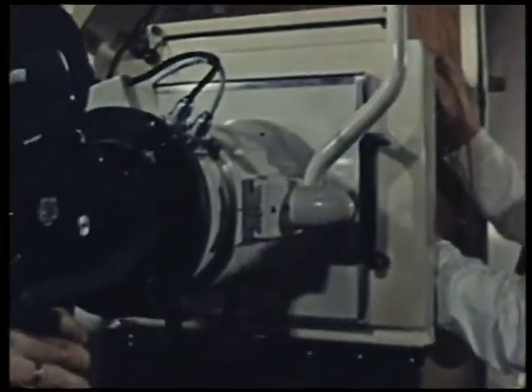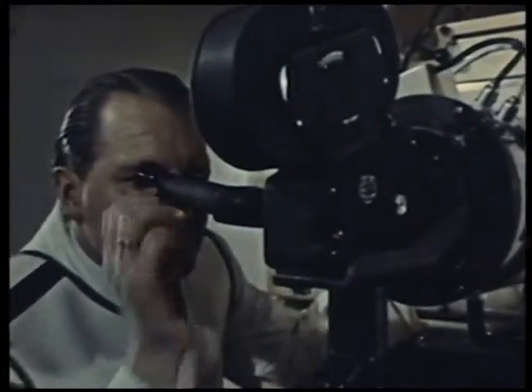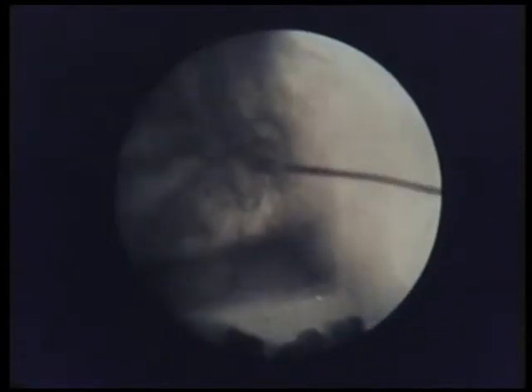Then, by means of cineradiography, its further progress is observed. After it has passed through the posterior nasal aperture, it slides over the posterior nasopharyngeal wall into the laryngopharynx. It then passes behind the epiglottis and pauses just above the vocal cords. It passes between these and into the upper part of the trachea.